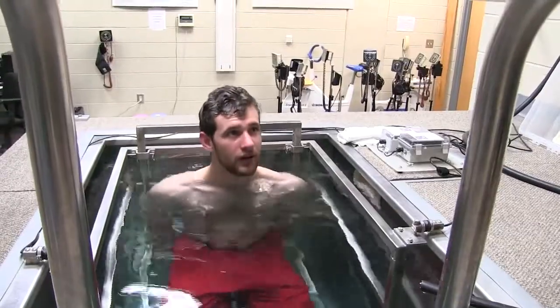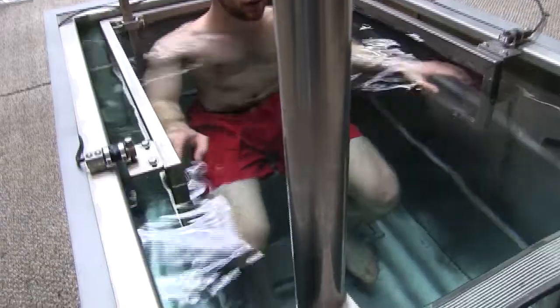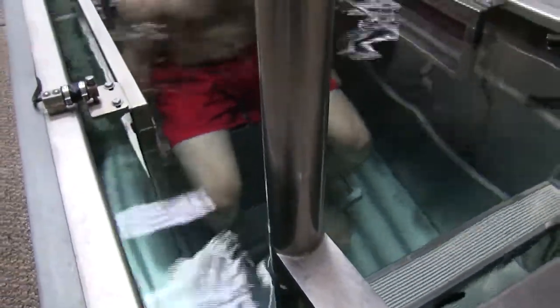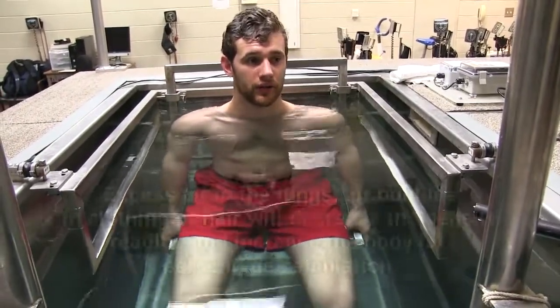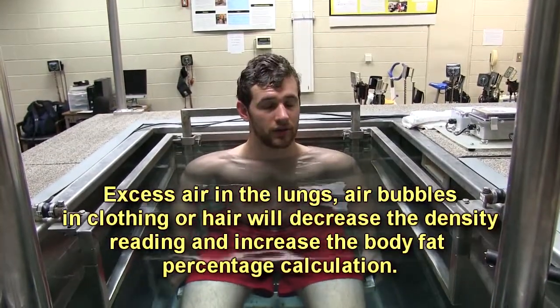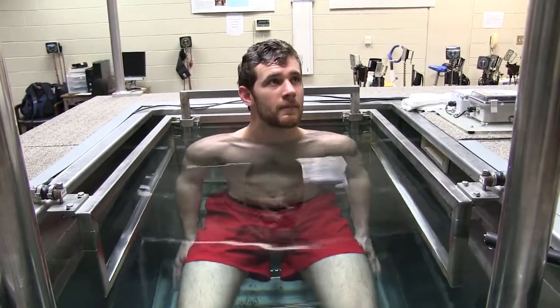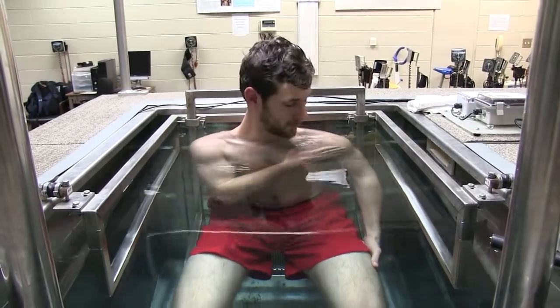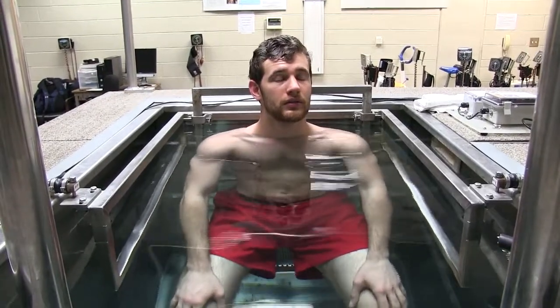For the first test, put your feet on top of the foot platform and hold on to the seat next to you — not the handlebars, but down where you're sitting — and maintain that position the entire time. For accuracy, we need to make sure you get all the air out of your lungs, because that affects how much you weigh in the water. Above water, breathe out as much as you can, and then as you go under, give every last bit out of your lungs. I can't start the test until I stop seeing air bubbles, so get all the air out as fast as possible — you don't want to be under there too long.